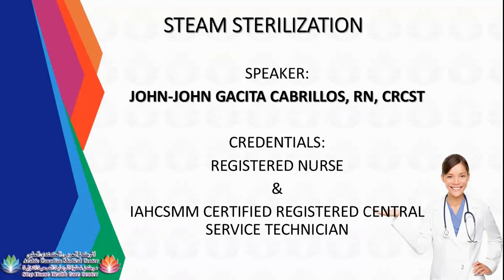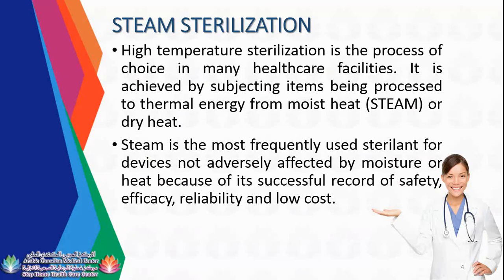Hello guys, let's continue. Actually, this is our final discussion for today. So, I will focus on steam sterilization. So, steam sterilization is a high temperature sterilization process of choice in many healthcare facilities, whether it is hospital, medical center, small clinics, it is the primary first option.